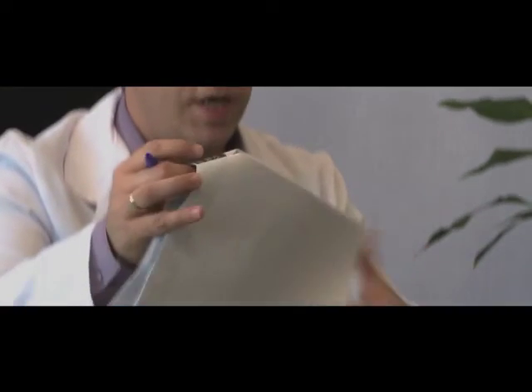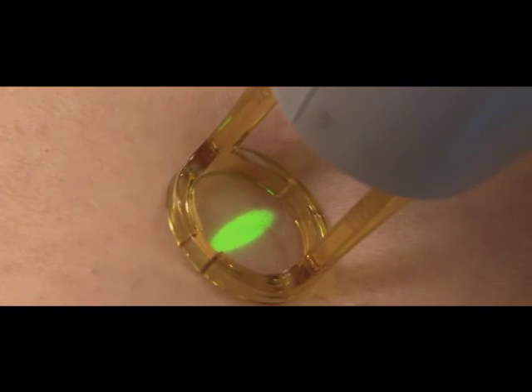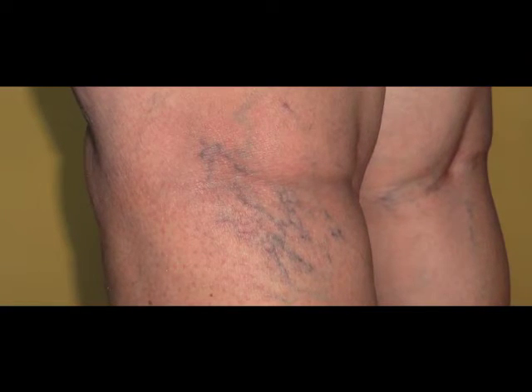Again, it is important to review the initial consultation portion of the video to make sure a thorough initial consultation is performed. In the case of vascular lesions, pay special attention to making sure there is no underlying venous insufficiency, which requires previous diagnosis by ultrasound.